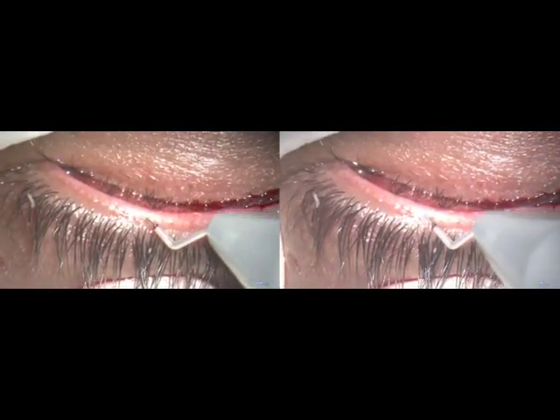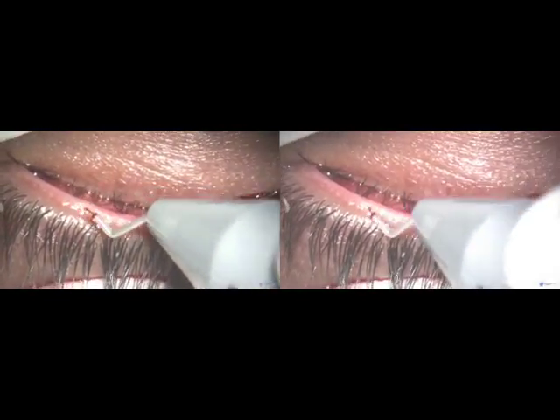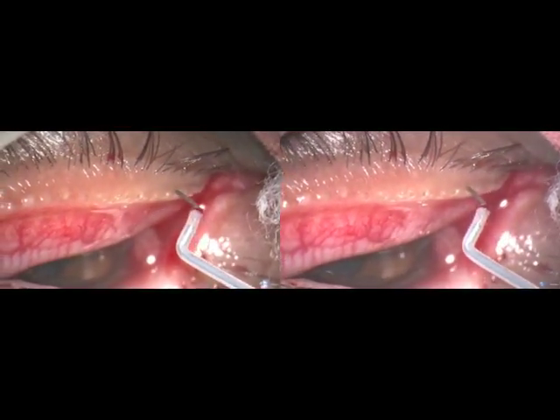The lid turns in such a way that it becomes perpendicular, so you can push the Fugoblade tip into the lid. It goes parallel to the tarsal plate so that it will not get out of the tarsal plate and hit the eye. The same thing is done to the lower lid. It is so simple — it only takes a few minutes to clear all the meibomian ducts.